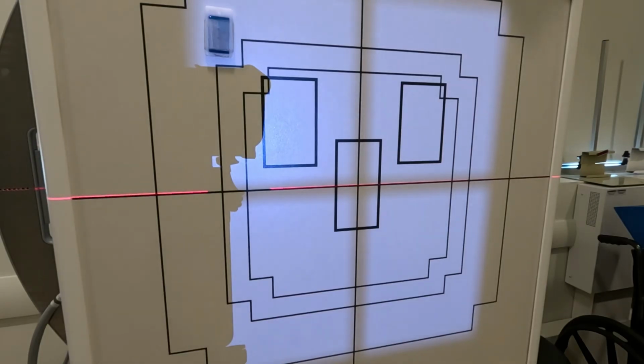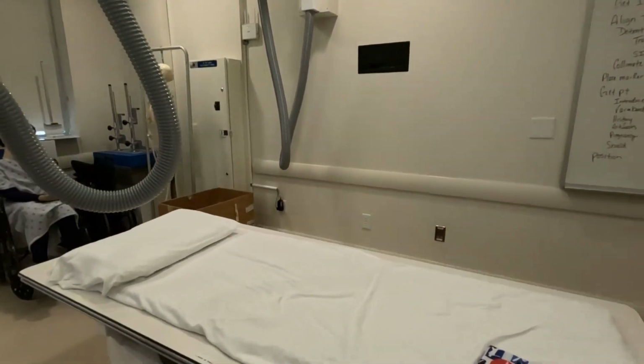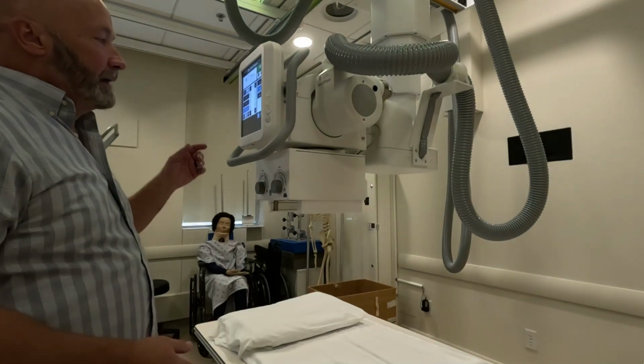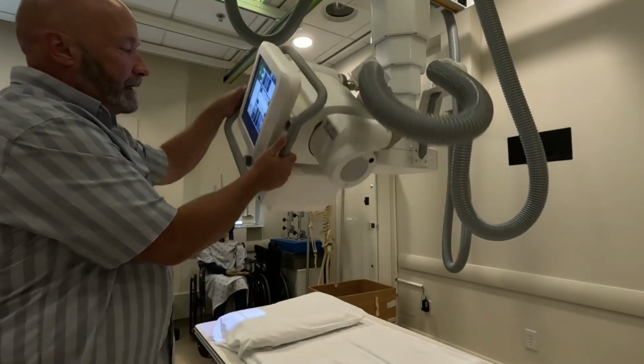So it's basic tube operation. Familiarize yourself with the x-ray tube. Familiarize yourself with the preferred detents and where they are. We have another set of detents for the table. So if your technologist tells you to lock it into the table, first thing that you want to do is make sure that you're not pointing at the wall. Make sure that you have it pointed at the table.